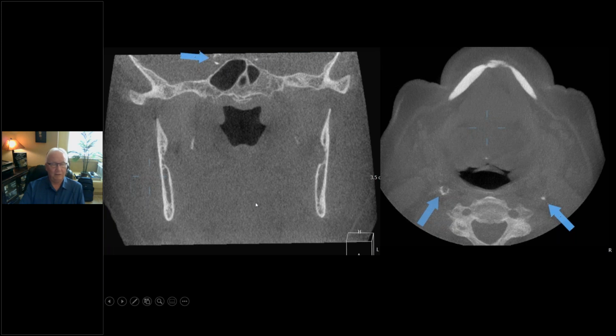I don't expect a lot of people to know that, but if they're circular, if they go around the vessel, you're going to find out in the next 10 or 15 slides that this is probably a type 2 diabetic that's either undiagnosed or pre-diabetic, or they're uncontrolled.